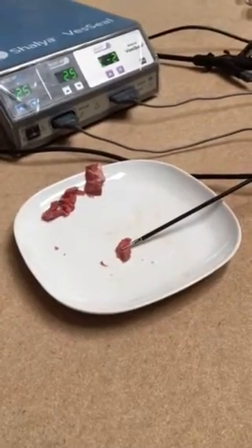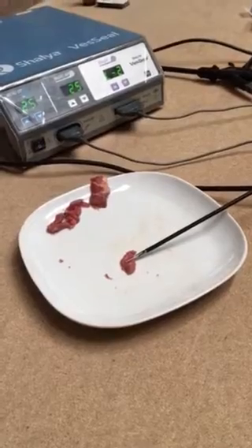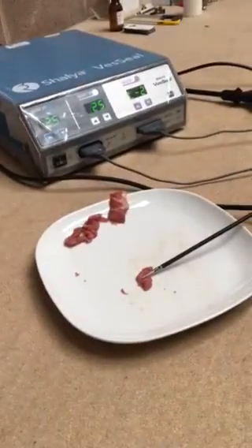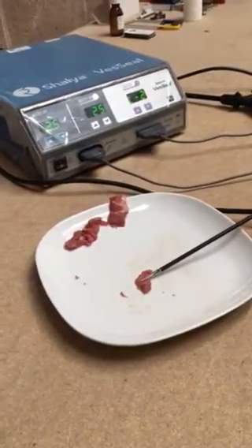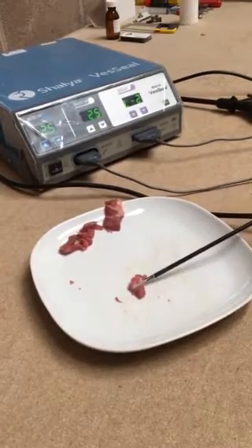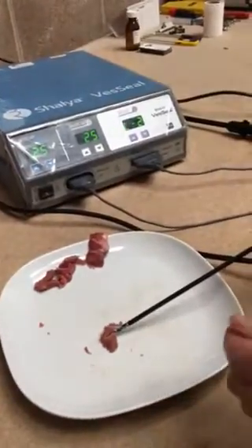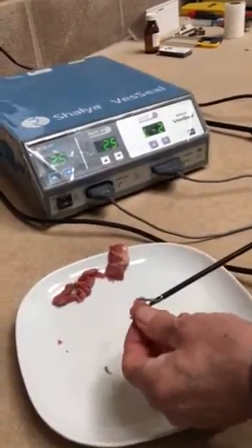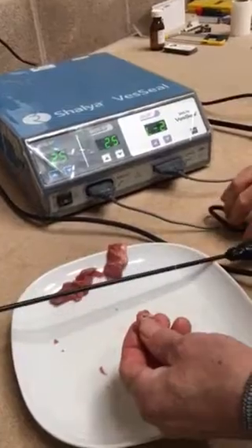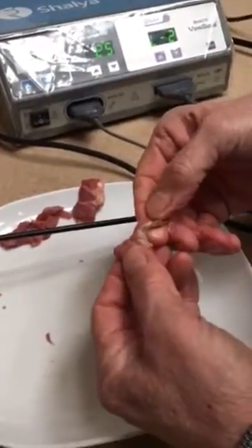With the bipolar forceps attached and a 25 watt setting, we'll now depress the foot pedal. This is using the 5mm instrument on bipolar. Now we'll look at the tissue, and you can see where the tissue is sealed and cut nicely.